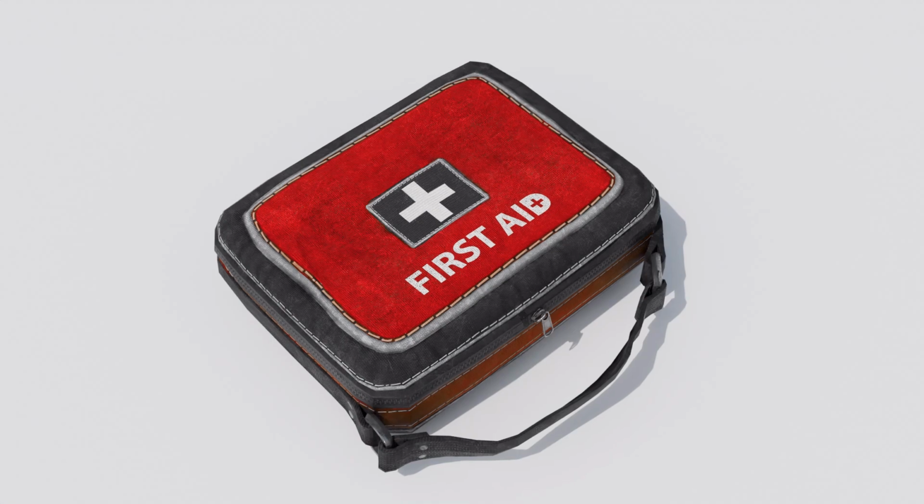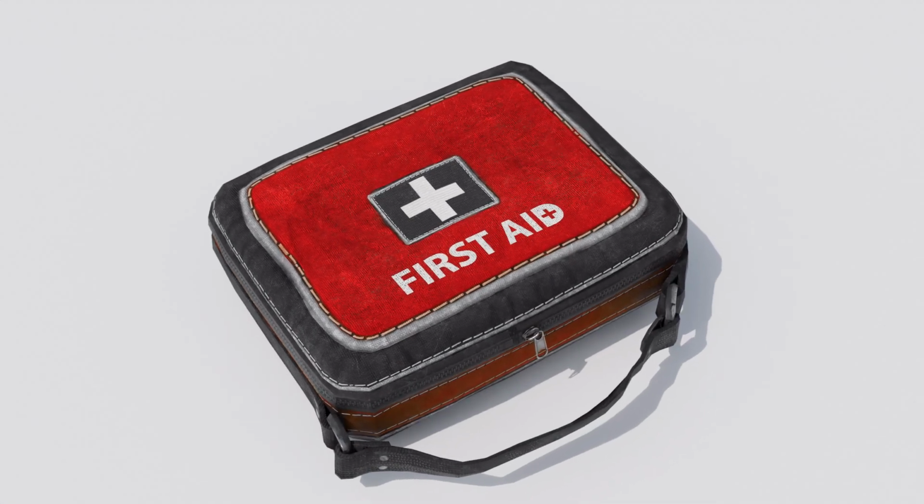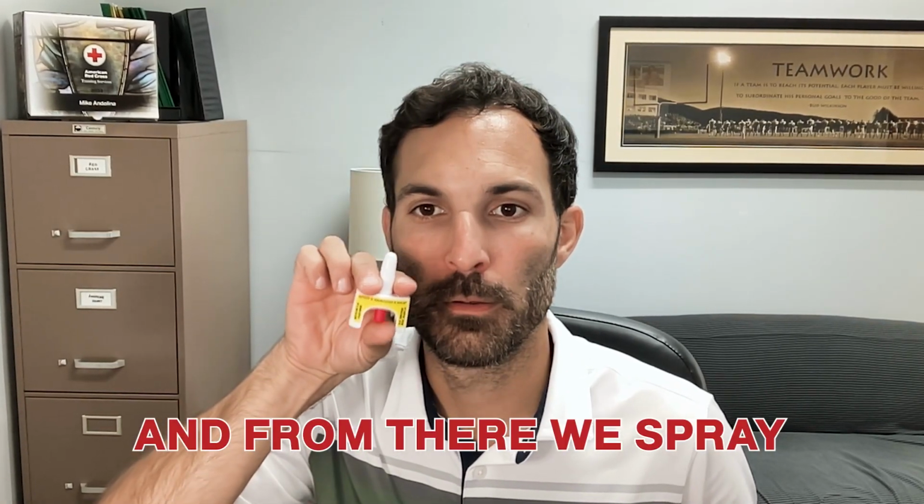The nasal spray is relatively straightforward. You peel the package off the back, take the spray out. We place 2 fingers across the top, and hold at the bottom. We go up the nostril until your fingers are touching the bottom of your nose, and from there, we spray. This is a 4 milligram dose of naloxone, otherwise again known as Narcan, that we would administer to a person experiencing an opioid overdose.